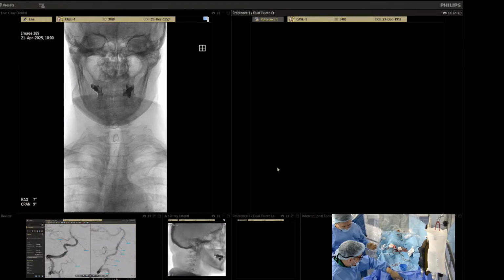The catheter is unstable. Fubuki ver. I will try Fubuki. Fubuki should go distally. That's why the distal long sheath, or yes, today it looks like a cardiology procedure.